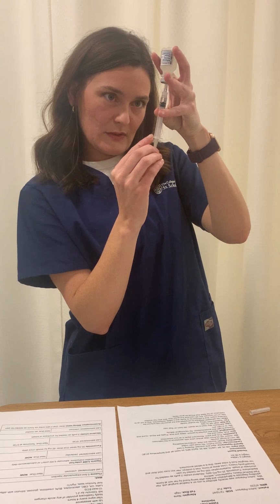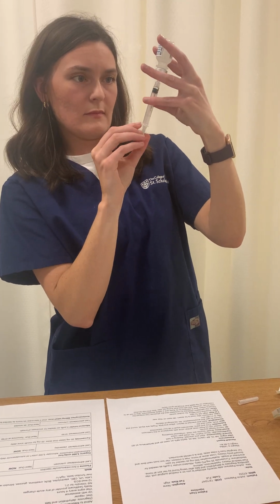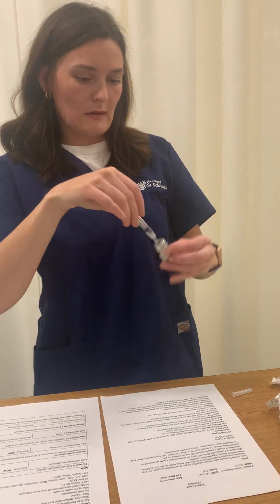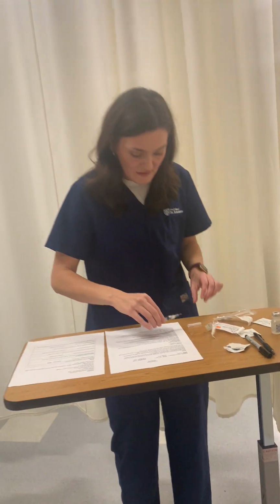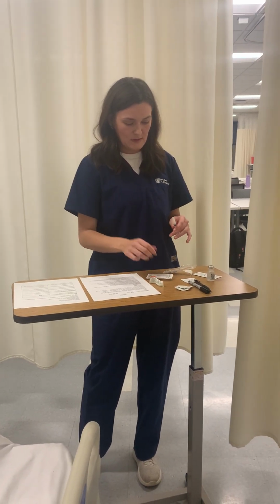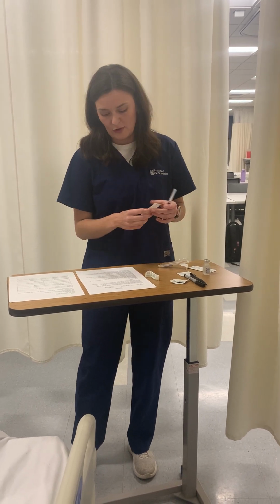Looking for bubbles, which it's making a ton of bubbles with this. I'm going to remove this. I'm going to safely recap this. And I would put this in my sharps.